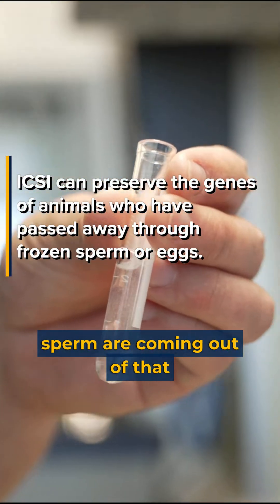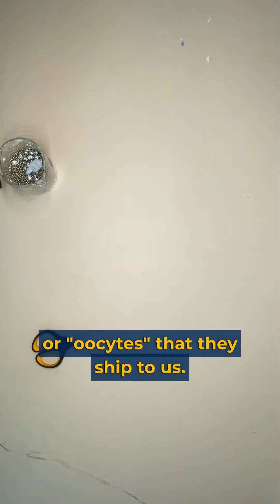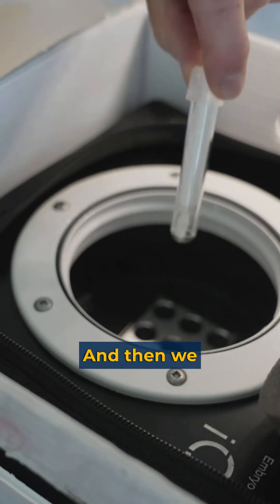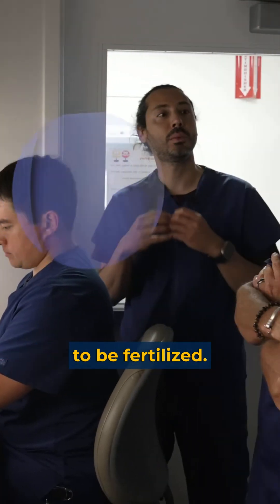Now the sperm are coming out of that tiny piece of straw. We also have the eggs, or oocytes, that they shipped to us. You can grab it and then we go to the lab — we need to put them in a special media to be ready to be fertilized.